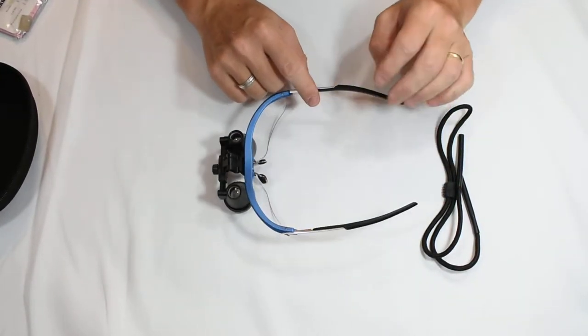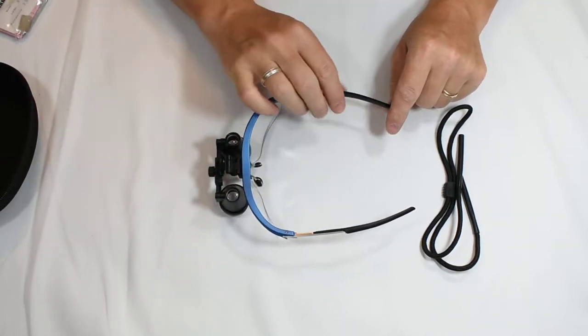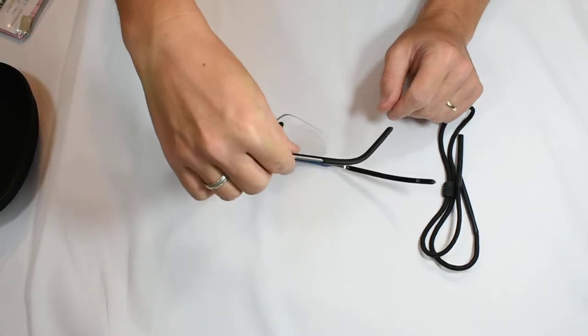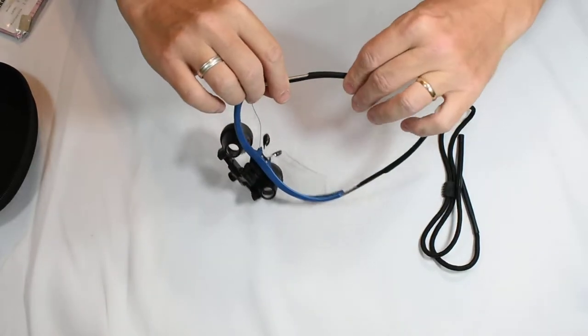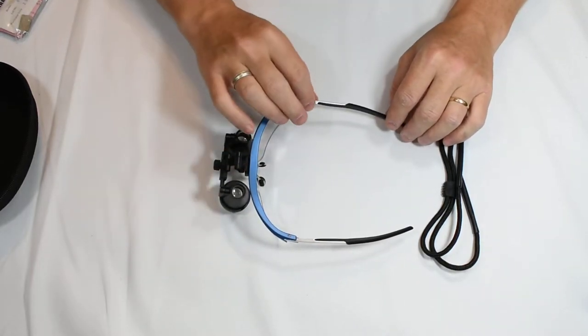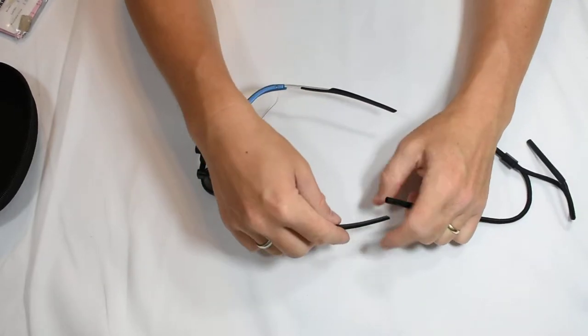So opening up these loops, the first feature that I want to show you is on the frame itself. These earpieces are bendable and can be adjusted to any angle. This is a very important feature when fitting them to your face. You'll want them to hold behind your ears.